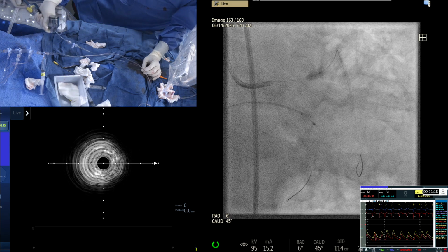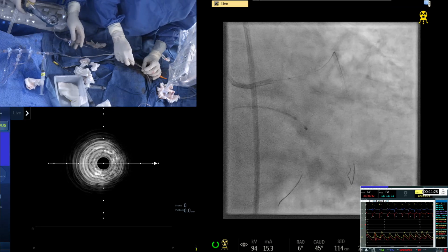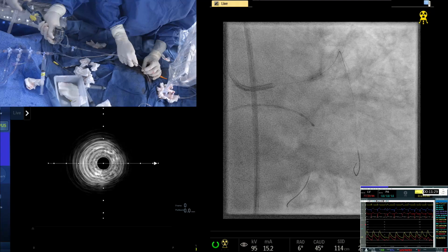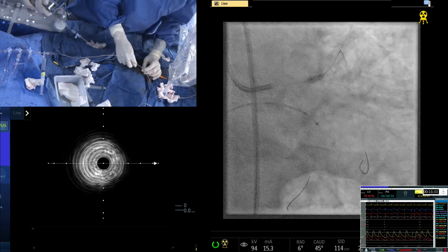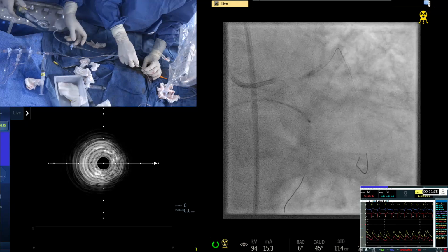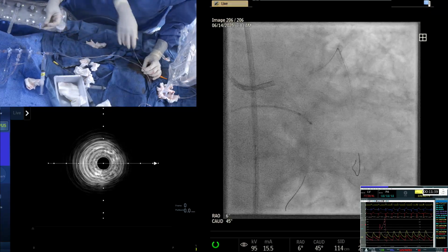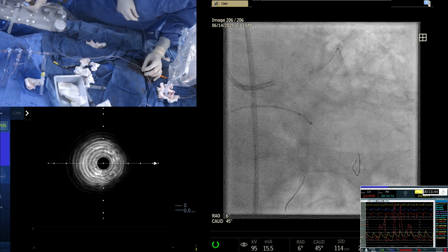Now we are going to use our eyes. The best IVUS. Okay, we're going back there. Yeah, we need a long 3.5 by 38. Another 3.5 by 38. Okay, let's do the IVUS. No, we do the IVUS of the circ, right? IVUS of the circ.